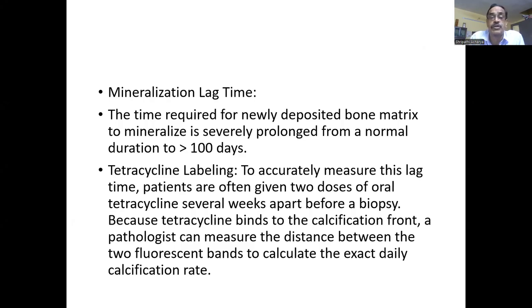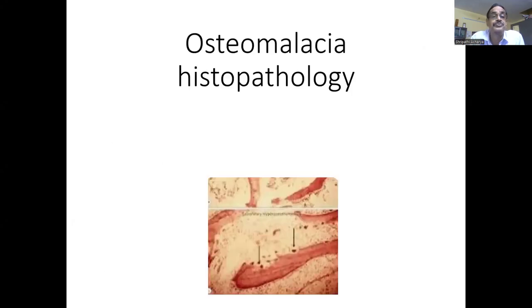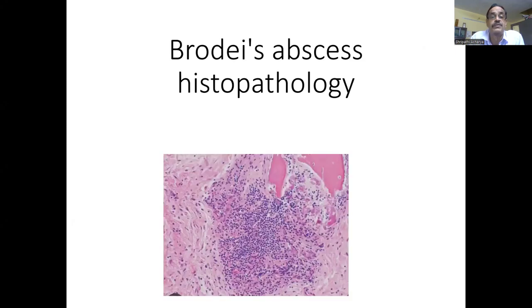Tetracycline labeling. To accurately measure this lag time, patients are often given two doses of oral tetracycline several weeks apart before a biopsy. Because tetracycline binds to the calcification front, a pathologist can measure the distance between the two fluorescent bands to calculate the exact daily calcification rate. In the slide of osteomalacia.